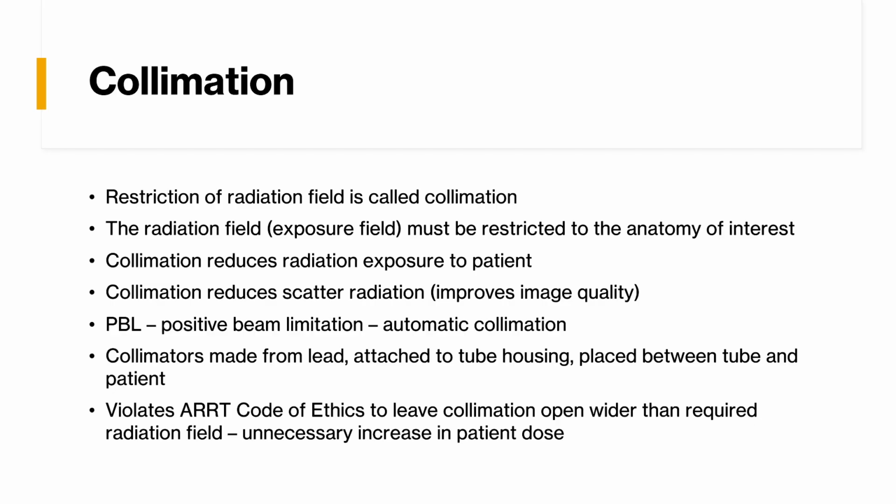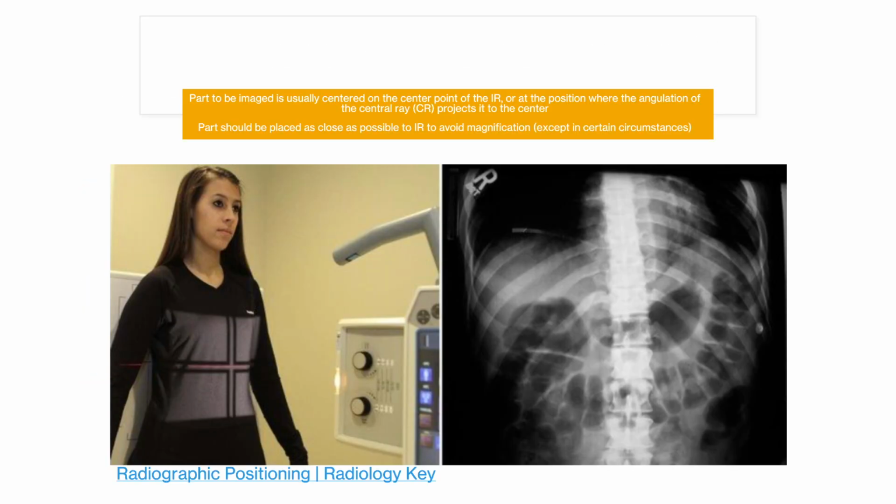You've heard me reference collimation as well. This is cropping the light that we see that surrounds the patient. So when we're looking at this, all of this light is what's going to be exposed on the patient. This room's really bright, but we could usually see where that light is coming outside of the patient as well. And we won't need a lot of air to be exposed to x-rays because the larger the collimation, the less the resolution is going to be.